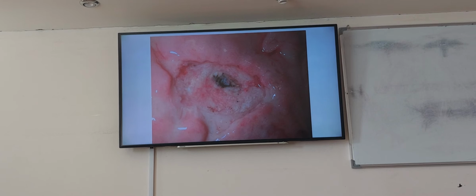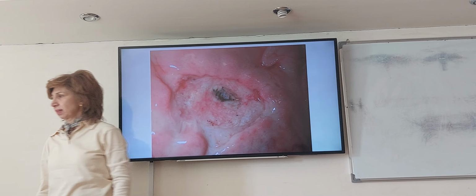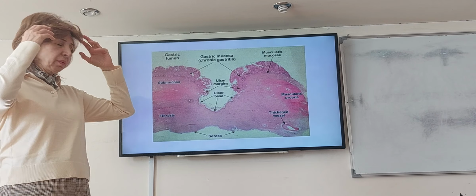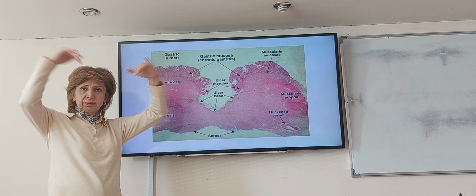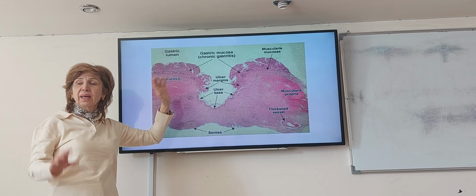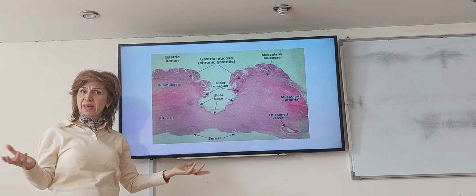Now, this is another one. Yeah? Always look. It is lower, and look at the edges, they are radiating. Now, I will put the micro and tell me what do you see. According to the chronic. Remember the chronic, according to the picture, gross. What do you see? This is the central ulcer, and these are the folds that will radiate. Yes? Everyone could imagine? Now, the radiating ones are normal. Yes? We saw them. Normal, smooth surface, radiating.